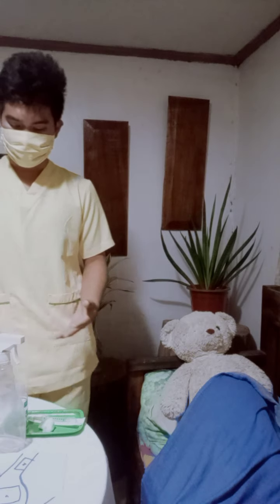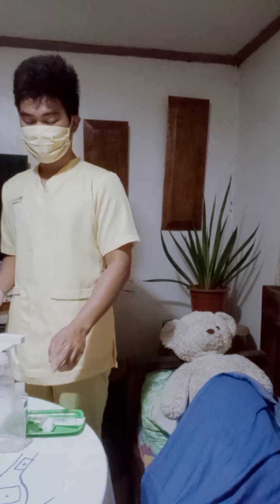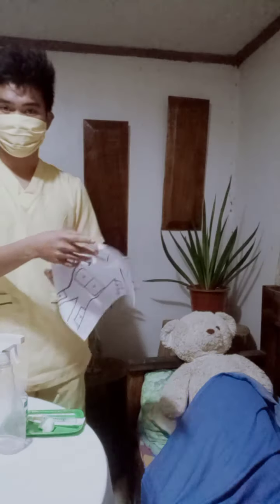So we have here the equipment needed. I have here the alcohol, the syringe, the cotton balls with alcohol, the vial, and the chart of the injection site.